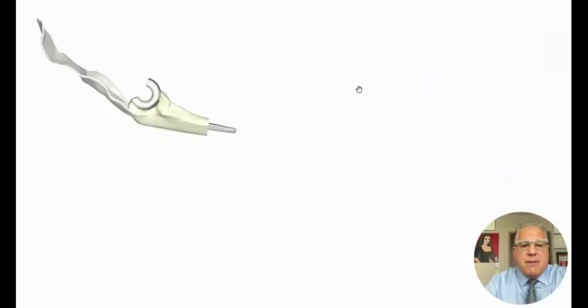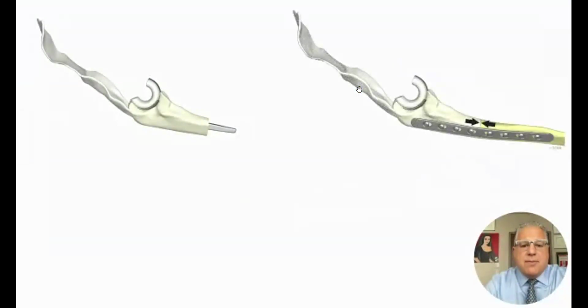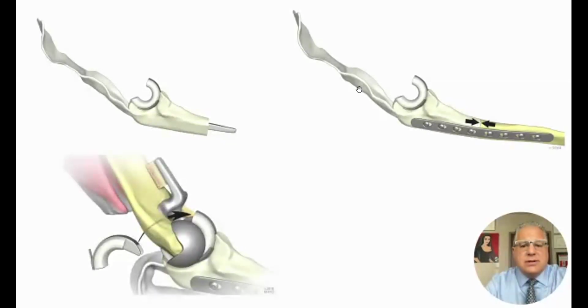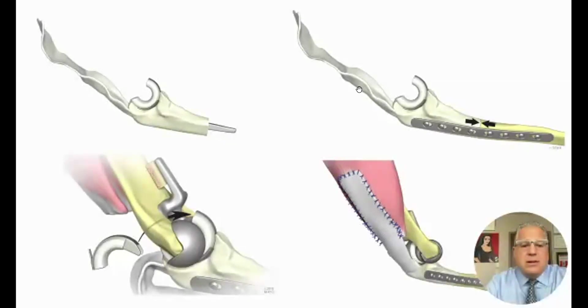The technique involves preparation of the ulna on the back table, compression plating of the graft to the host, linking the prosthesis, and then repairing the triceps muscle of the patient to the triceps tendon allograft.